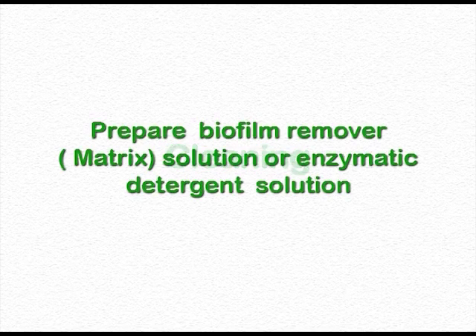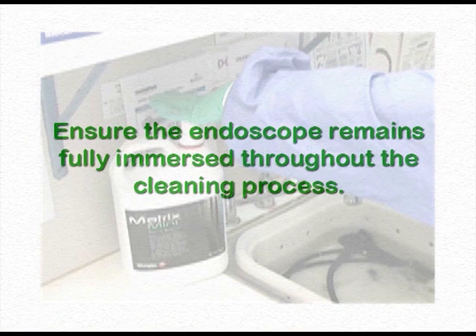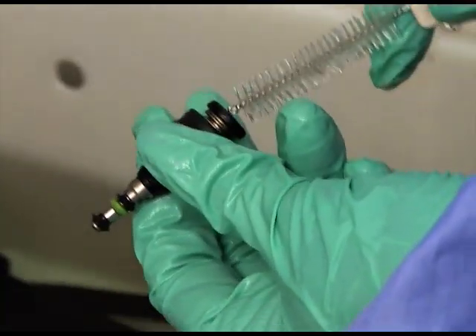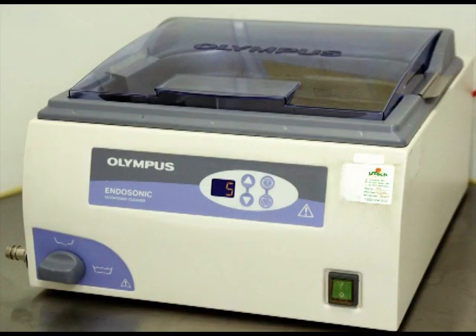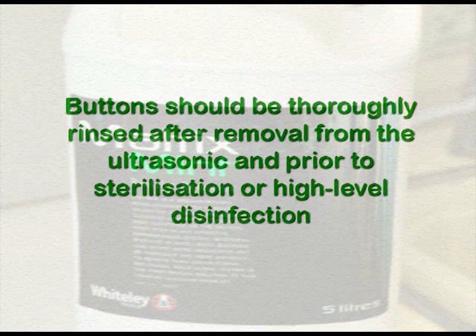Prepare fresh biofilm remover, Matrix solution, or enzymatic detergent solution as per the manufacturer's instructions for reprocessing each endoscope. A fresh solution prevents cross-contamination. Ensure the endoscope remains fully immersed throughout the cleaning process. Brush and clean non-disposable parts with a small soft brush, paying particular attention to all surfaces and lumens. Place buttons and valves in the ultrasonic; Matrix biofilm remover may also be used in the ultrasonic. Buttons should be thoroughly rinsed after removal from the ultrasonic and prior to sterilisation or high-level disinfection.